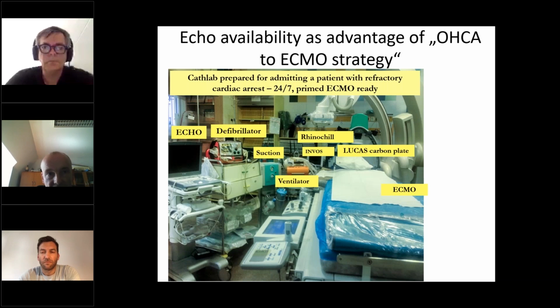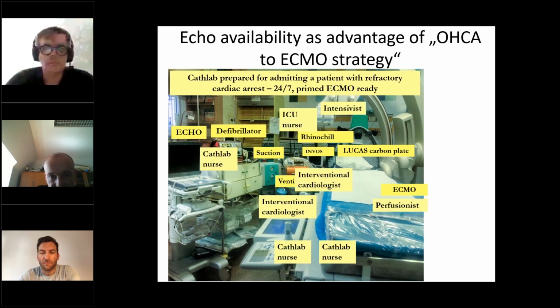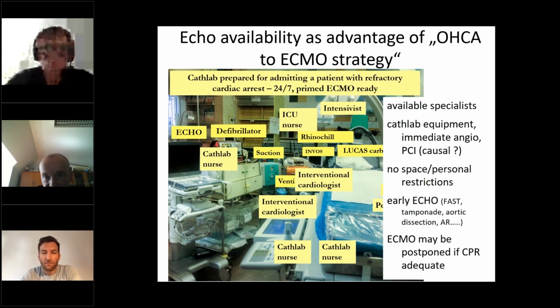Why ECMO and echo? If you think about, for example, patients in shock, or actually patients with cardiac arrest, and typically a patient with an out-of-hospital cardiac arrest, we prefer to take a cardiac arrest to ECMO rather than running with the ECMO somewhere out of the hospital. And the reason is that there's everything available, and also the echo. Echocardiography can be performed immediately in the form of FATE and FAST, and can be extended for a proper echo anytime. And what you need to exclude at the beginning is a non-cardiac cause of cardiac arrest, or a tamponade or aortic dissection or significant aortic regurgitation, which would be a contraindication to an ECMO insertion.